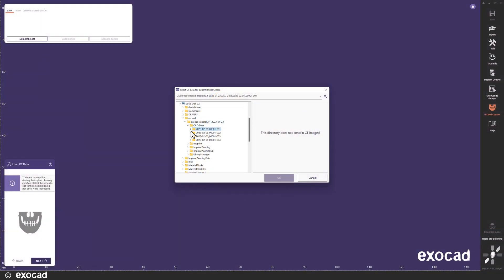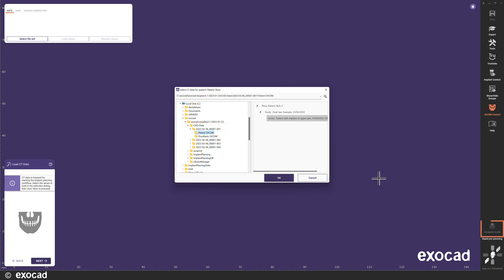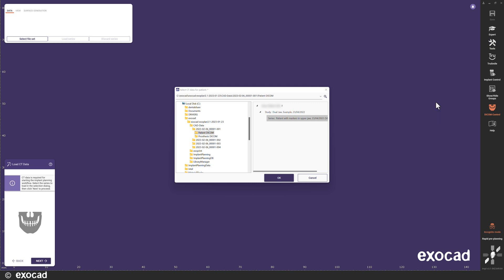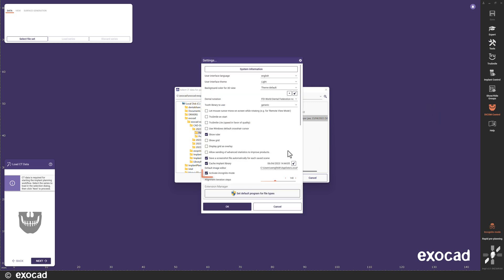I start by loading the DICOM data of the patient. In this version, we have added an incognito mode. When the incognito mode is on, the patient name is not visible. The feature can be activated in the settings menu.